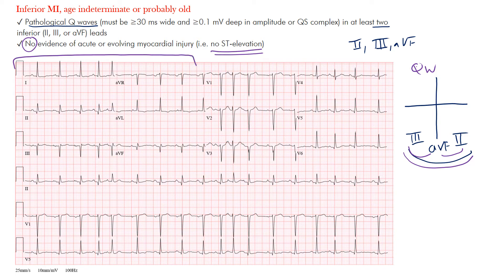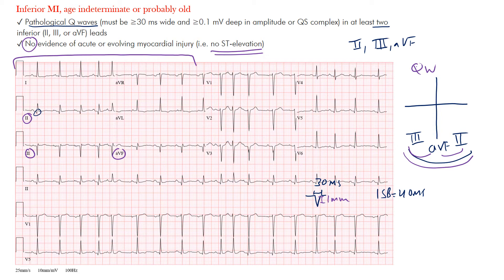Let's look at those inferior limb leads again — leads II, III, and AVF. In lead II, you may see small Q waves that are reaching the criteria. Remember, we want the width of the Q waves to be at least 30 milliseconds — one small box is 40 milliseconds — and the depth should be at least one millimeter. Looking at AVF, you can see these Q waves forming. Notice in lead II there's no ST segment elevation, and no ST elevation in AVF either.